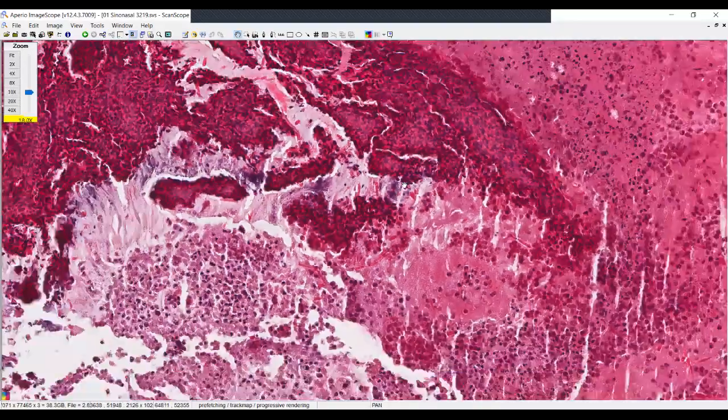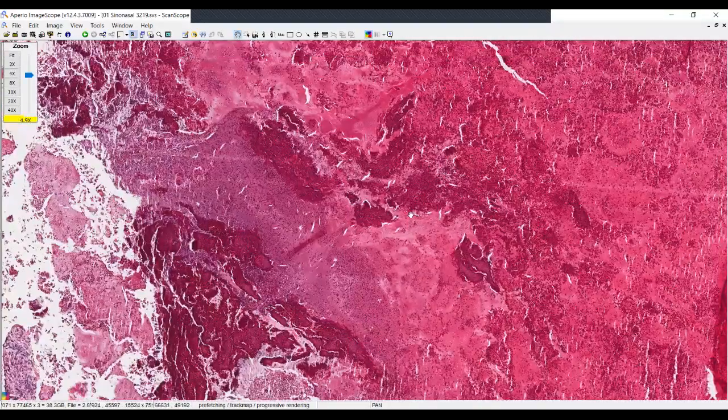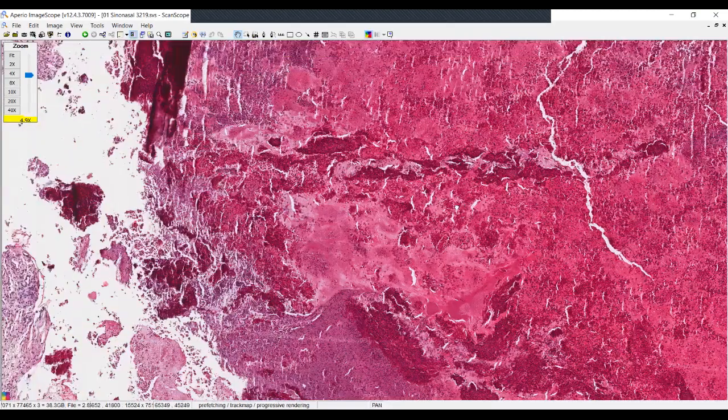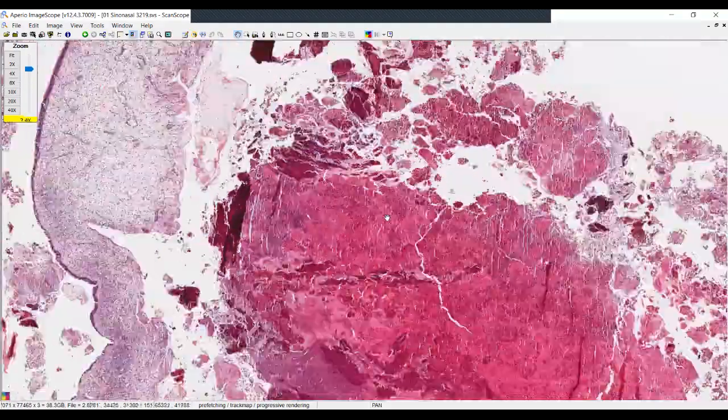So this is a nice example of allergic fungal sinusitis. Now, many times trying to find the fungal elements may be quite challenging, and in fact, I don't usually go looking for them specifically in this case, but if you wanted to do a stain, I generally do a PAS light green, as that is a much more effective stain than the GMS to be able to allow me to see this.